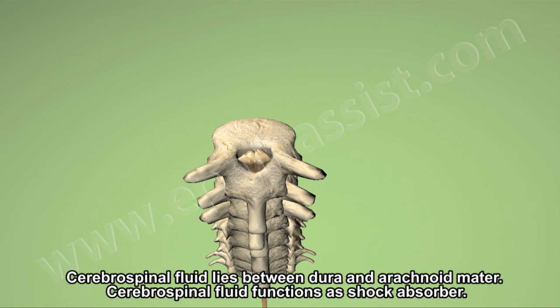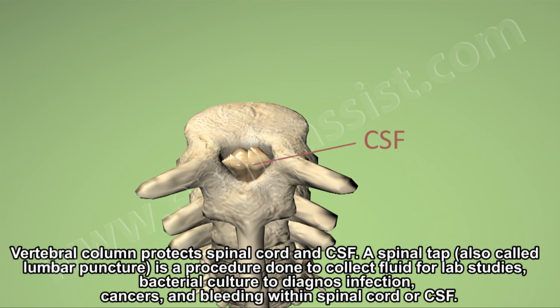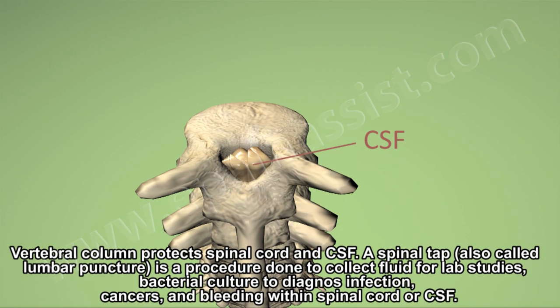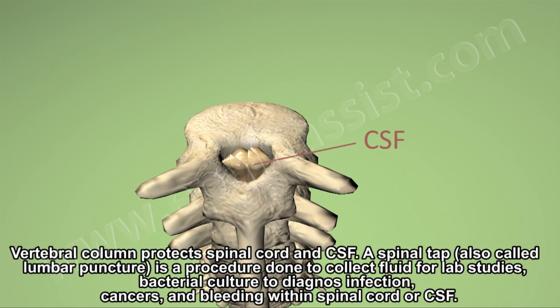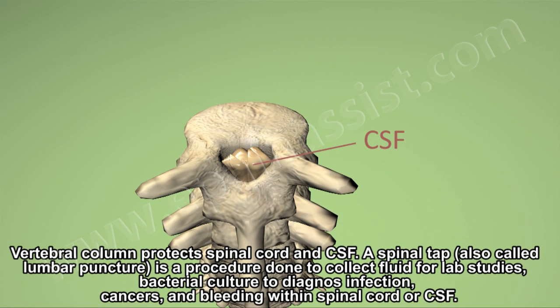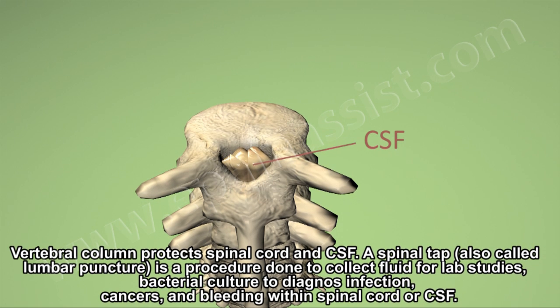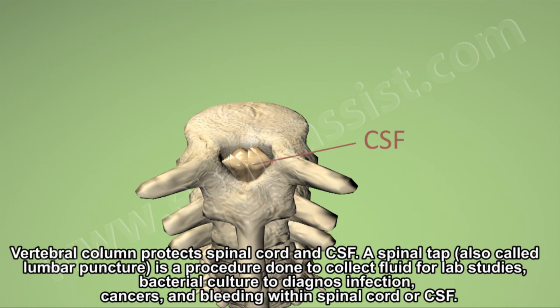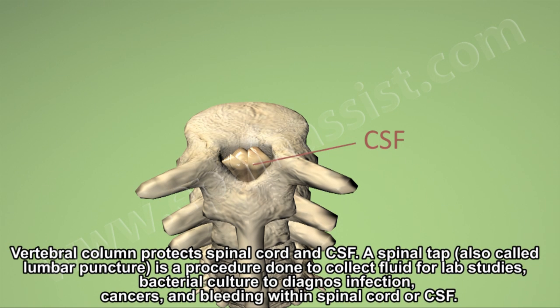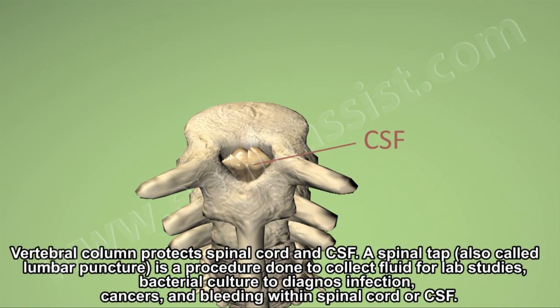Cerebrospinal fluid functions as a shock absorber and protector. The vertebral column also protects the spinal cord. A spinal tap, also called a lumbar puncture, is a procedure done to collect fluid for lab studies, bacterial culture to diagnose infection, cancer, and bleeding within the spinal cord or cerebrospinal fluid.